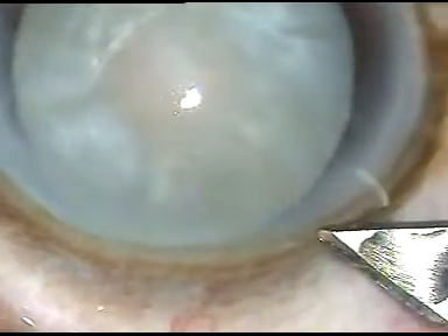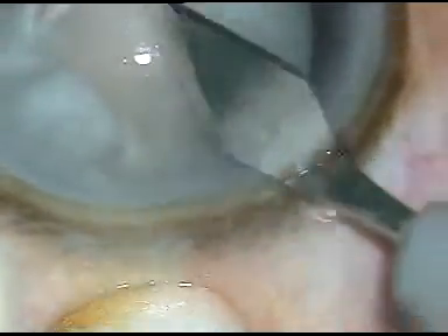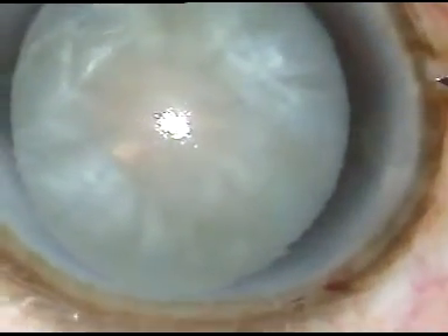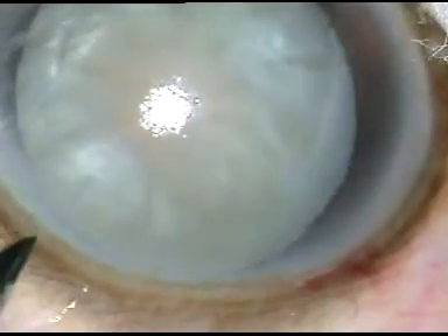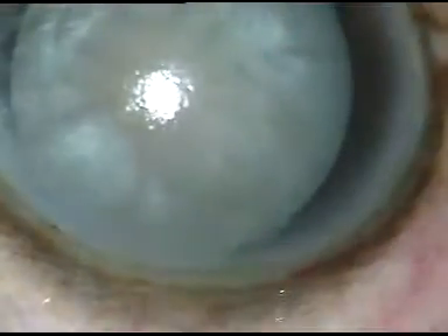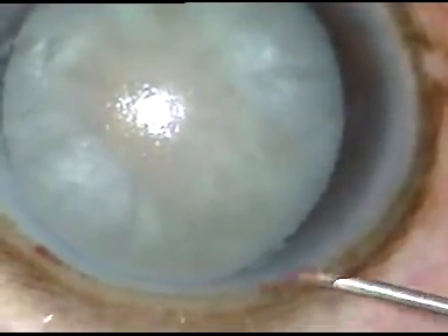Dear colleagues, today I did three cases of intumescent cataracts. This is the first case. I do capsulorhexis of intumescent cataracts using only HPMC, that is hydroxypropylmethylcellulose, as the viscoelastic substance. No other viscoelastic substance is used in my cases.